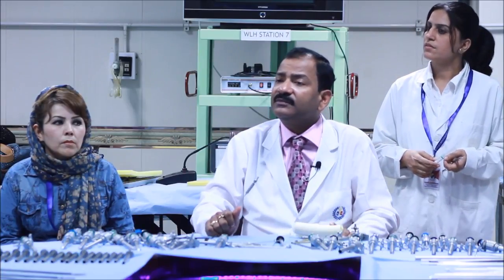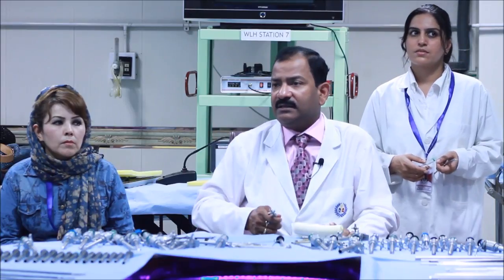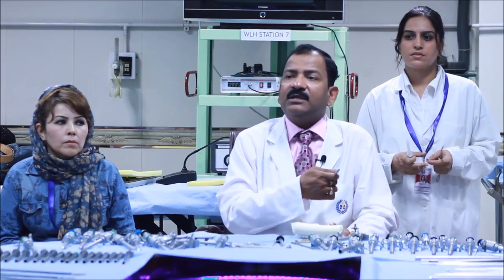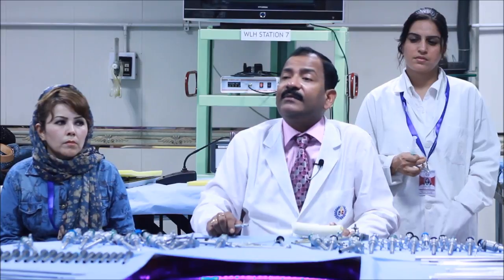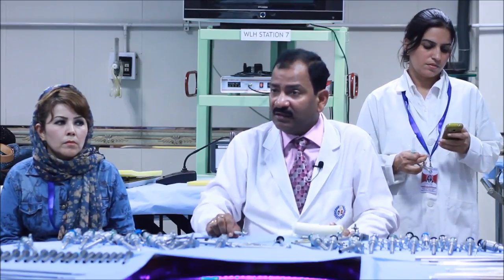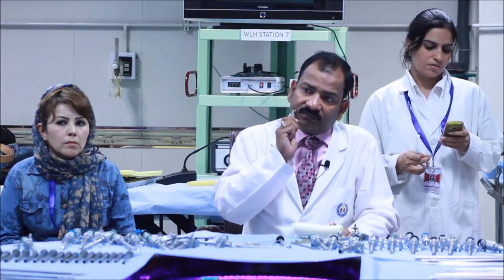Whatever the site, it should be 45 degrees to the horizon. No, only in the umbilicus. Yes, if it is Palmer's point, it should be perpendicular to the abdominal wall. Because Palmer's point, you are correct. If you point towards the anus, it will damage the splenic flexure of the colon. Isn't it? But pointing to the anus means that they are going backward. Pardon? It means you are going backward.